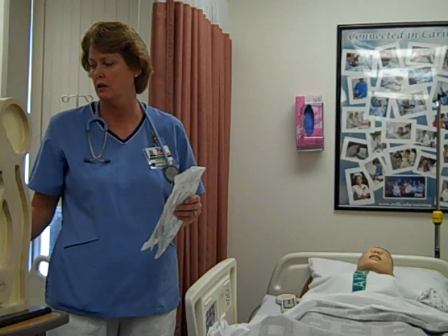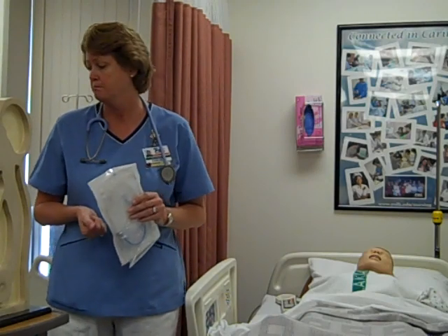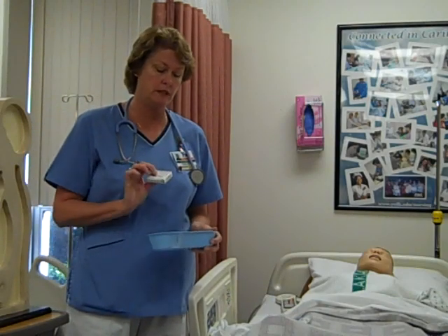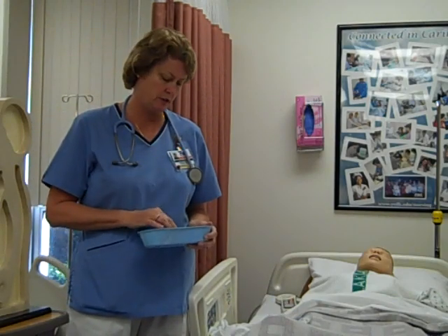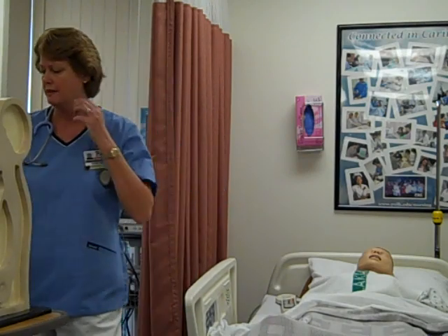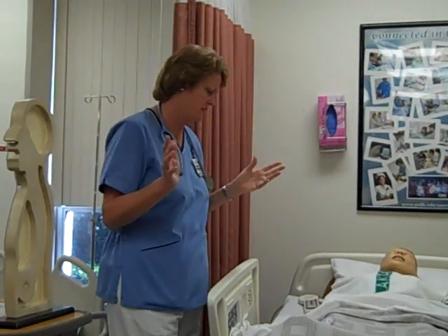We'll need a glass so the patient will be able to drink with a straw, normal saline, some lubricant, some tape, pH strips if they use that at your hospital, something to tape the tube with, a rubber band, a safety pin, and a syringe. I think that's everything.